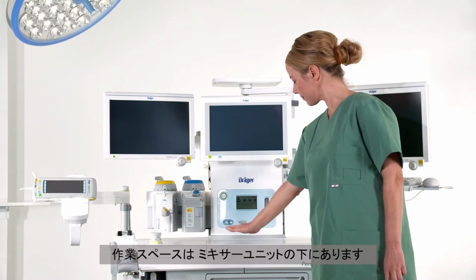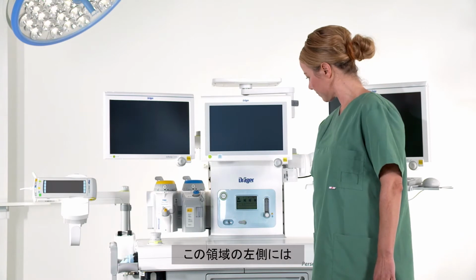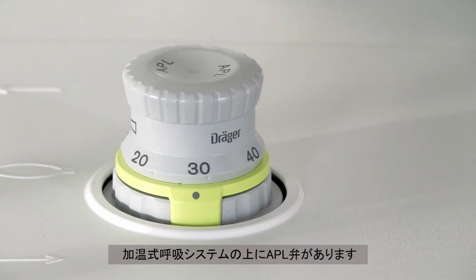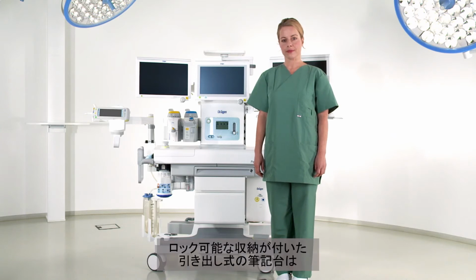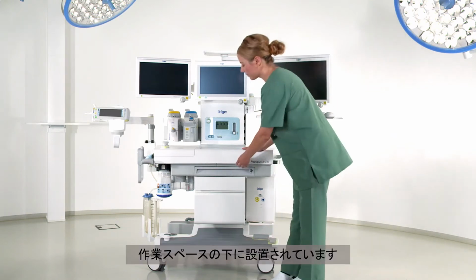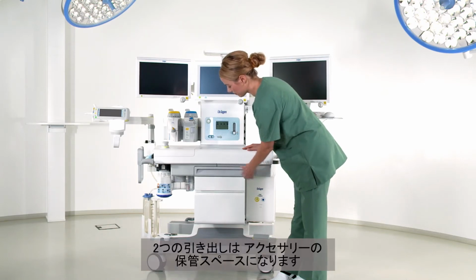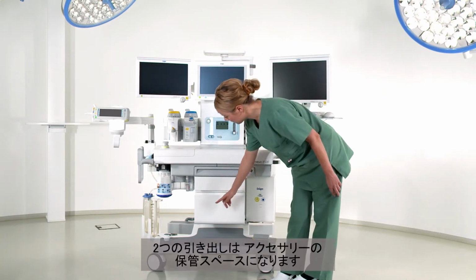A work surface is located underneath the mixer unit. On the left-hand side of this area, you will find the APL valve of the heated breathing system. A pull-out writing surface with a lockable compartment is located underneath the work surface. 2 drawers provide storage space for additional accessories.